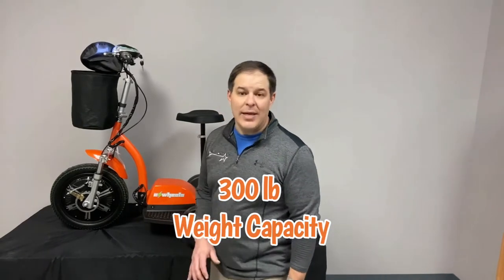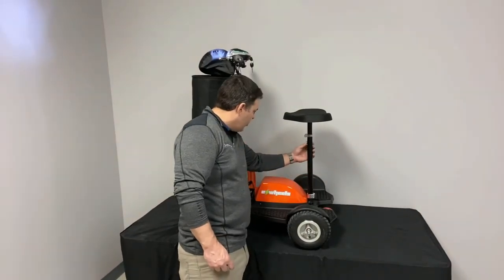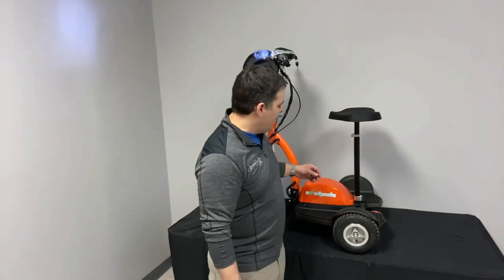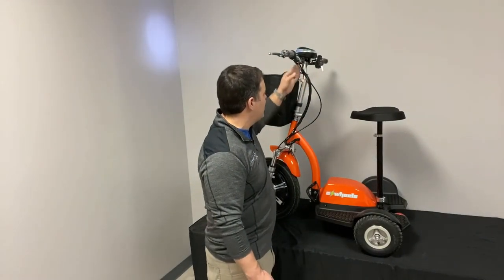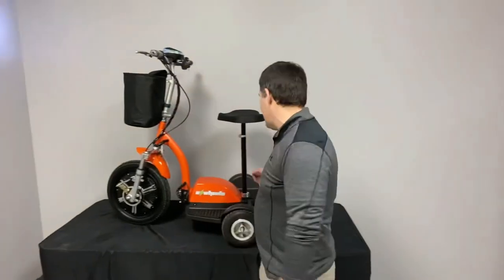It has a 300-pound weight capacity, so it fits pretty much all your needs. You can actually adjust this seat up and down — you have about four notches, so about a four-inch adjustment on the seat. You also have adjustment on the handlebars up and down to get the proper height. You can even take the post off, and that's why it's called a stand and ride — you can do both.